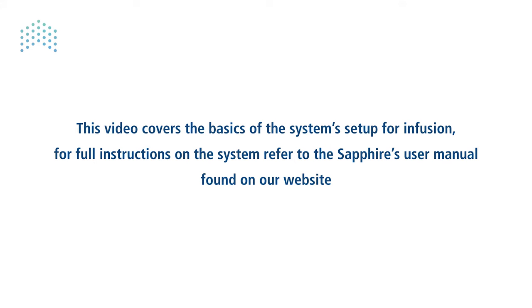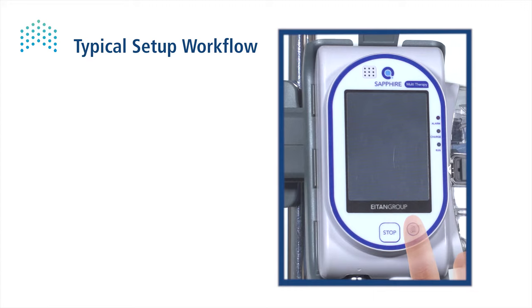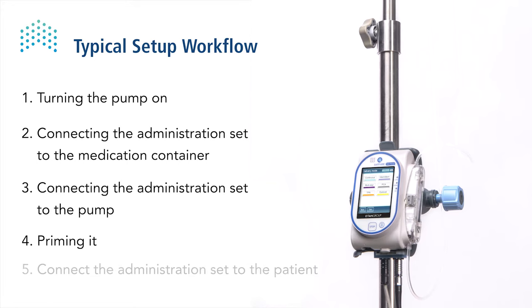This video covers the basics of the system setup for infusion. For full instructions on the system, refer to the Sapphire user manual found on our website. Setting up the Sapphire system for infusion includes turning the pump on, connecting the administration set to the medication reservoir and to the pump, and priming it.